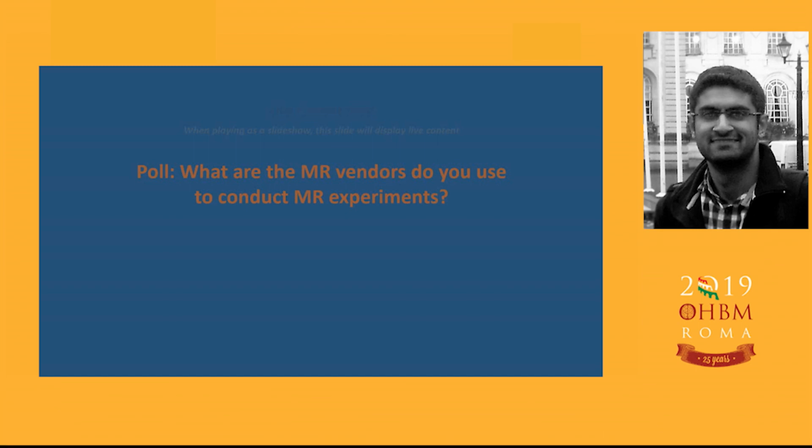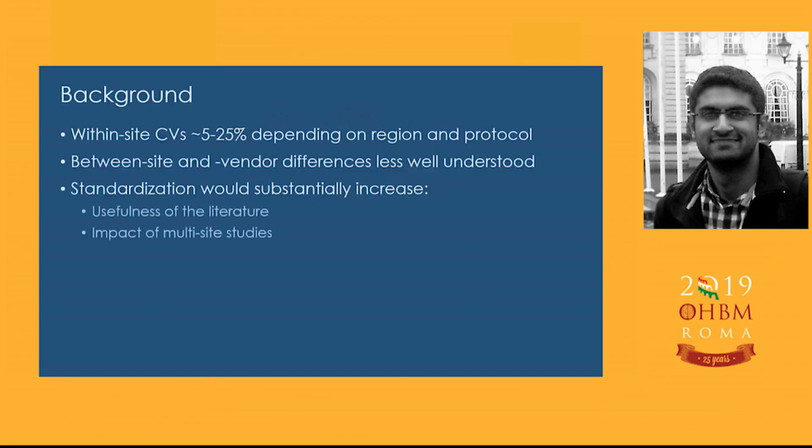So you can see different sites have scanners from different MR vendors, and this gives us motivation to have one sequence across all MR vendors, or at least a sequence that is standardized across all MR vendors, so that we can perform comparable multi-site studies. And so, looking into the background now.